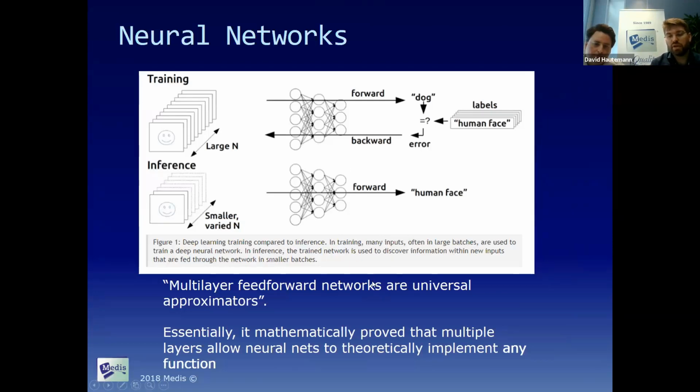And there's a lot of theory behind this as well, but basically you can approximate very complicated algorithms with such a network without actually much manual tweaking. There's no manual tweaking. The computer learns by just revisiting large numbers of data sets over and over again, and this way it learns.